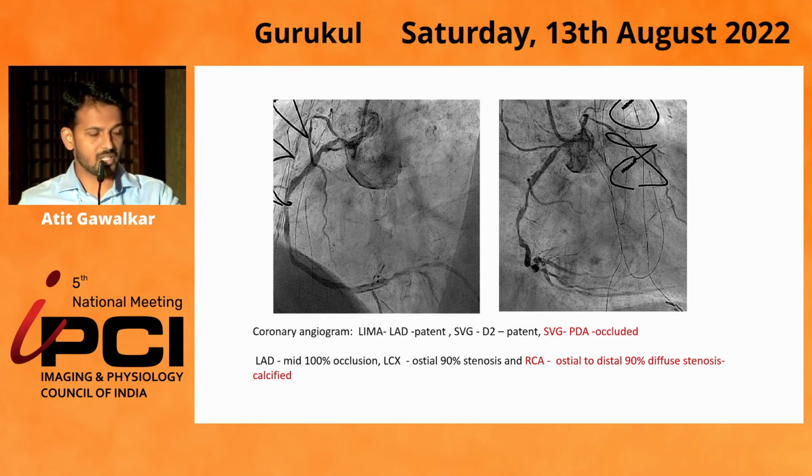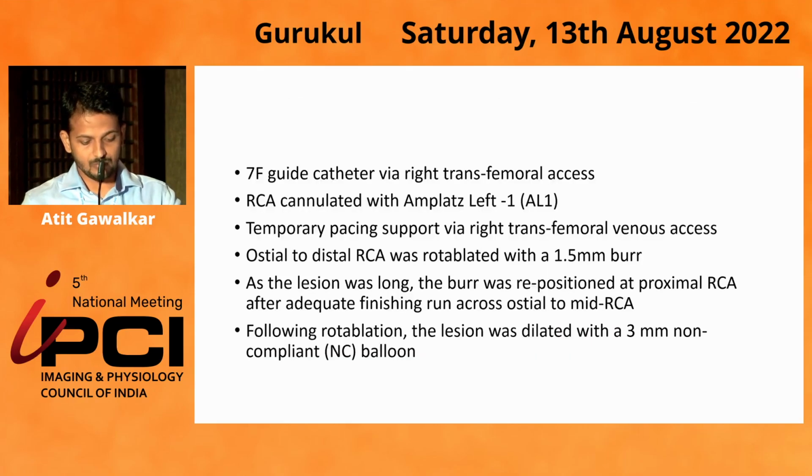So because of the symptomatic presentation, we decided to revascularize his calcified RCA. As you can see, the RCA is diffusely calcified and there is an ostial involvement too. So we discussed with the family and went ahead with the revascularization.